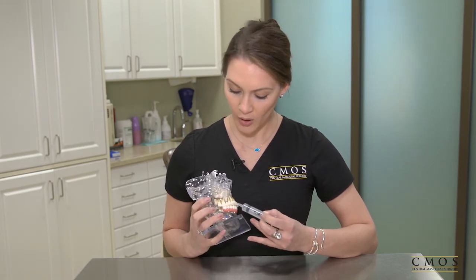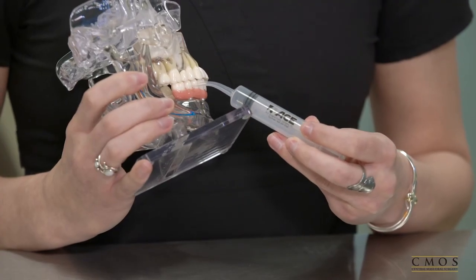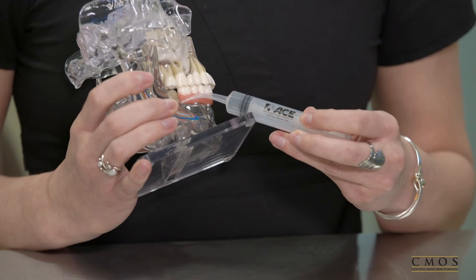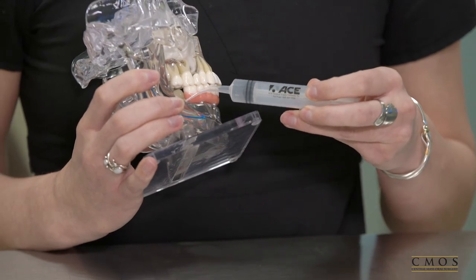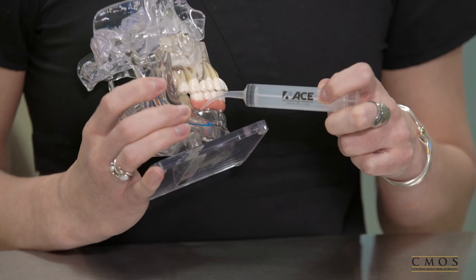For third molars or wisdom tooth surgery, if you are having a hard time finding where the extraction site opening is, you can follow with the hook of the syringe the line of the last molar in your mouth on the cheek side. From there, you will flush it out until the water runs clear.